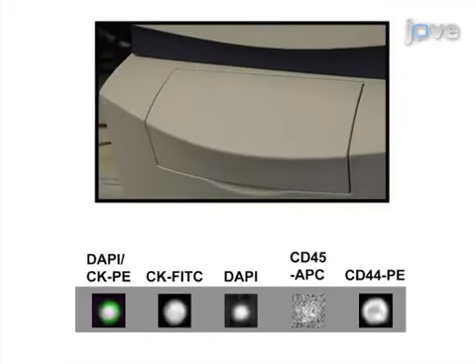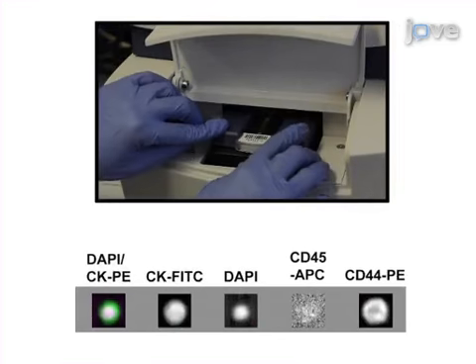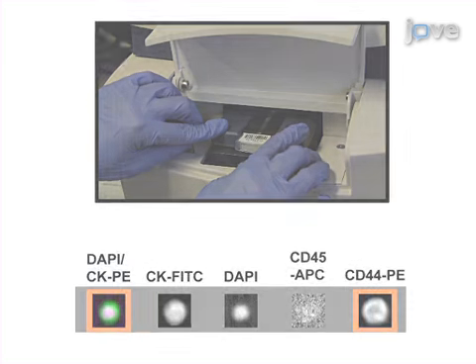Perform the desired molecular characterization of these rare circulating tumor cells in the laboratory to aid in the selection of targeted therapies for cancer patients in the clinic.